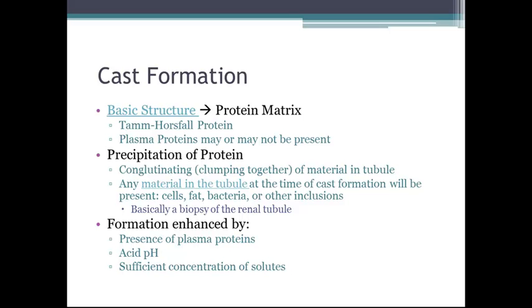Basically, a cast is a biopsy of the renal tubule. The outside lining of the renal tubule is then shed once the casts release from the tubular wall. Formation is enhanced by the presence of plasma proteins, acidic pH, and sufficient concentrations of solutes.